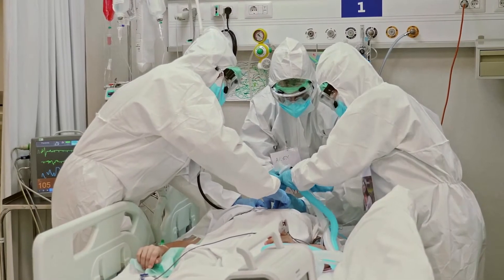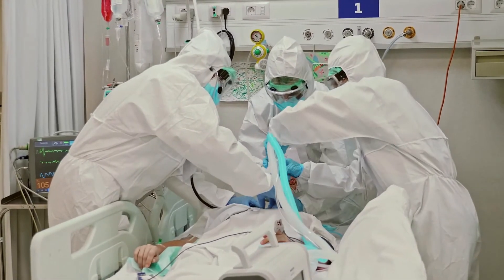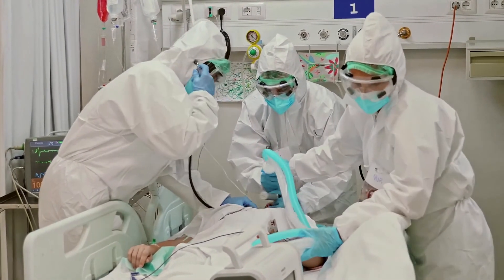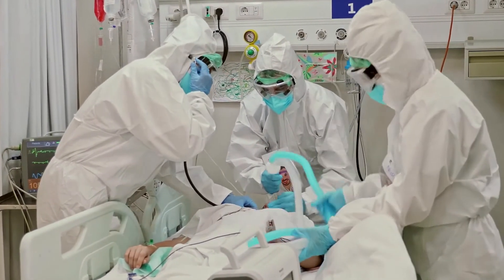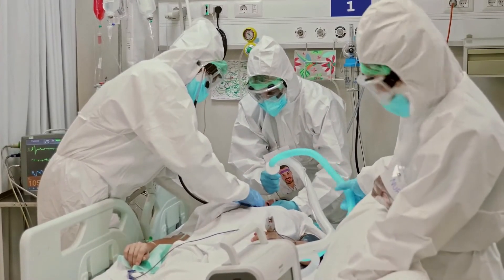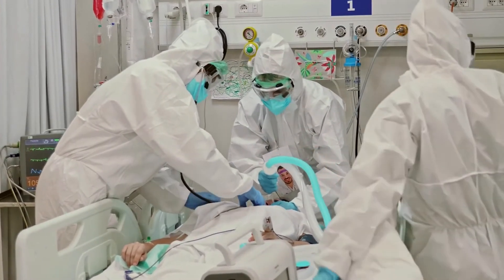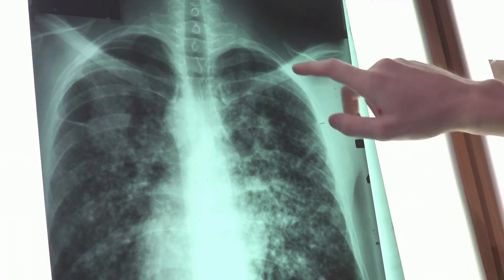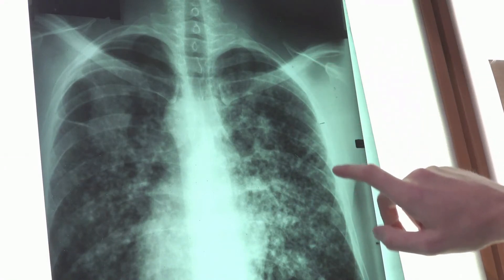Once the breathing tube is placed, the placement is checked by listening to the chest with a stethoscope and by detecting the presence of carbon dioxide on a monitor. The position of the breathing tube may also be checked with an x-ray.